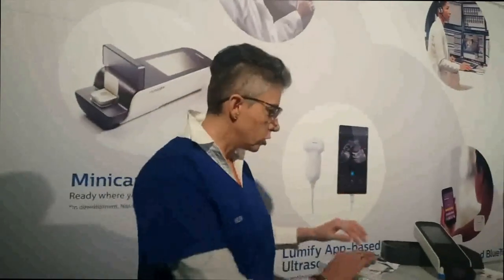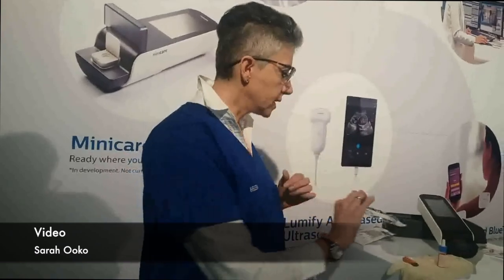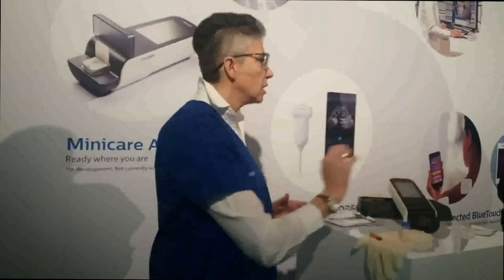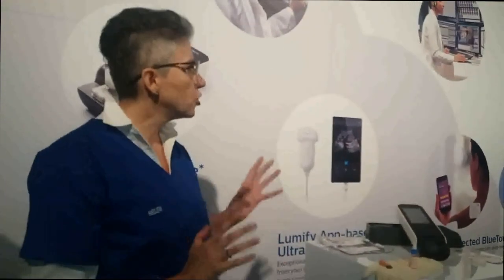Again, with this, all you do is use a different cartridge with the marked bilirubin. You'd select that, or the nurse would select that. Put it into the machine, prick the baby's finger, and within less than a few minutes, you know exactly what's happening with your baby, and the doctor can treat it.